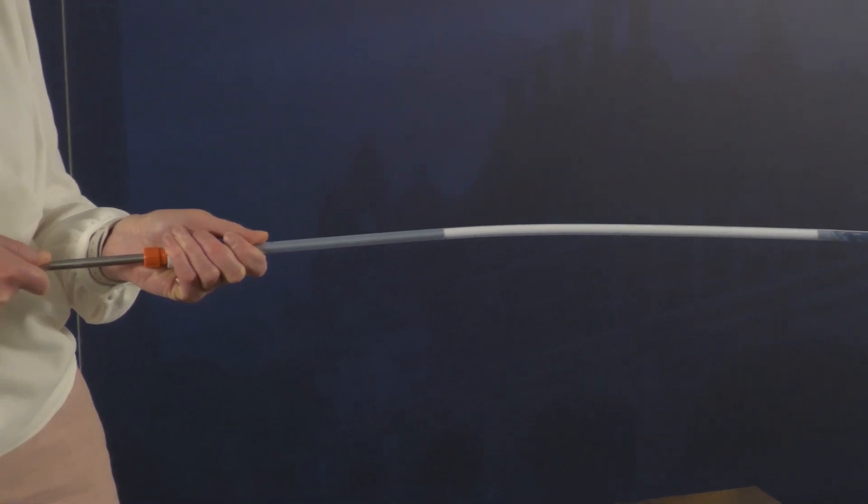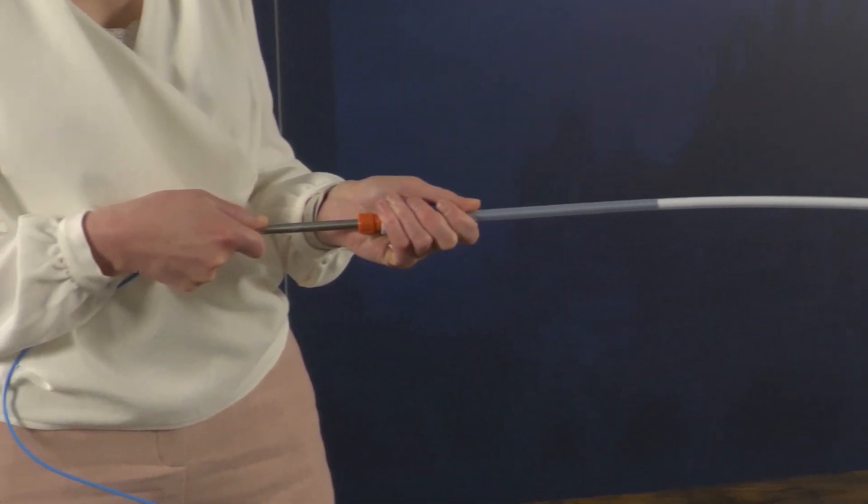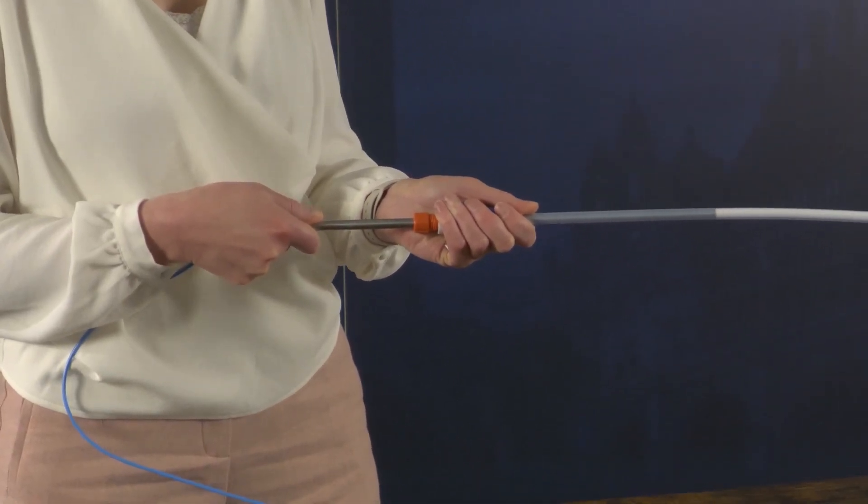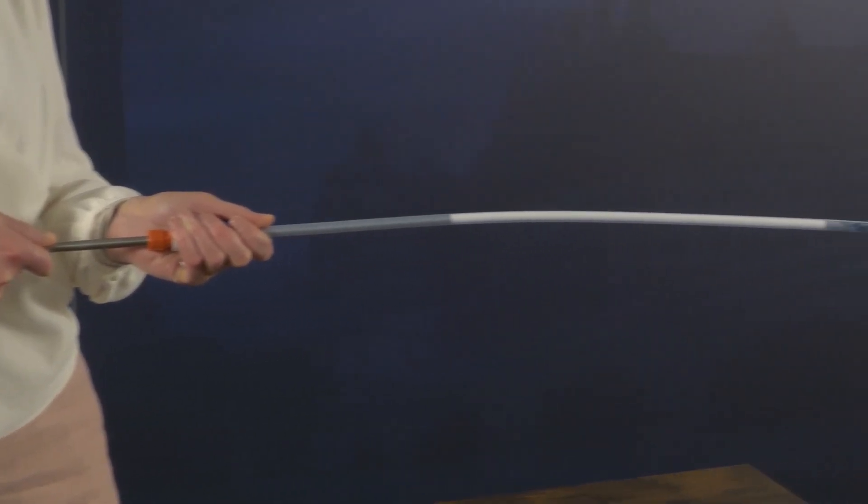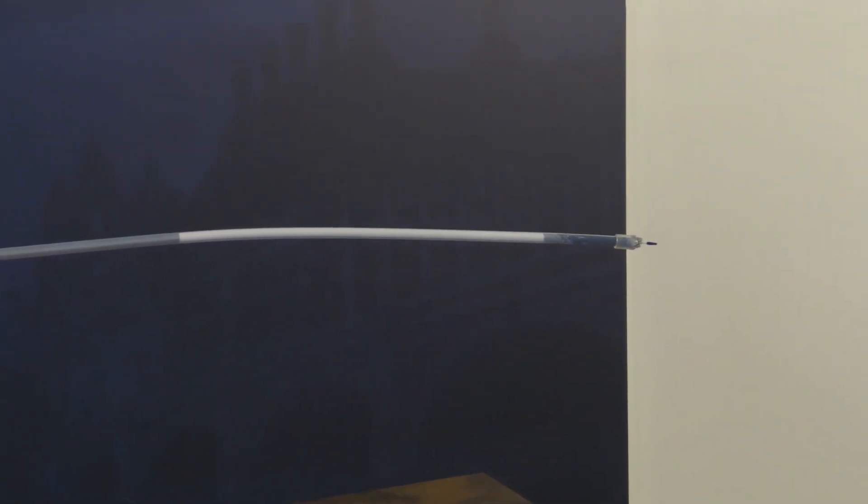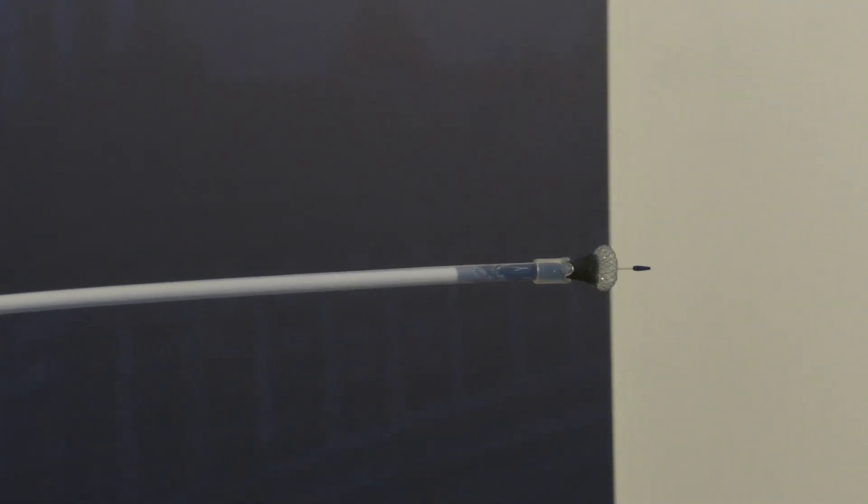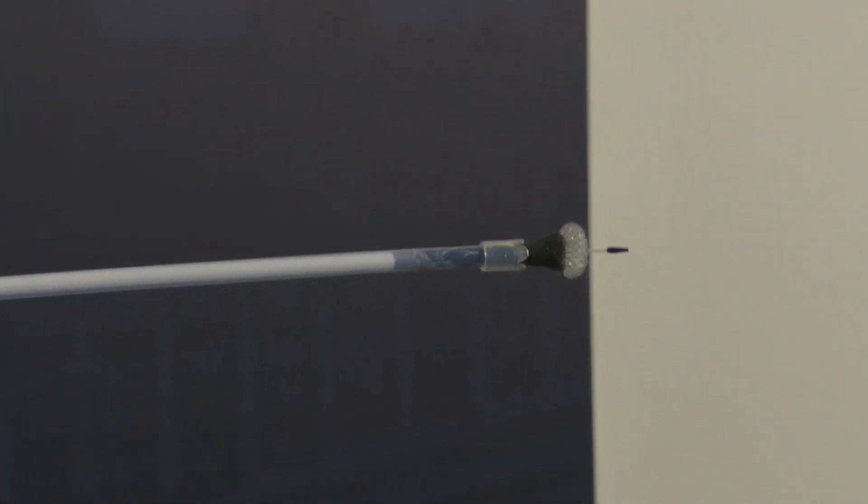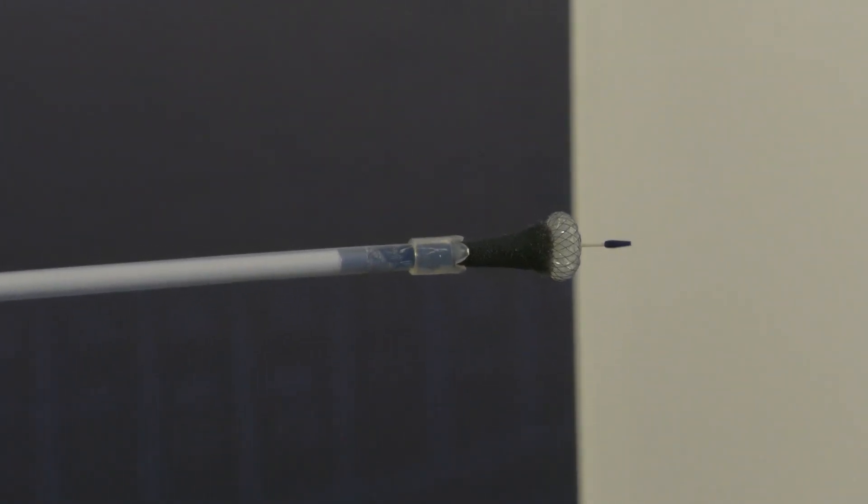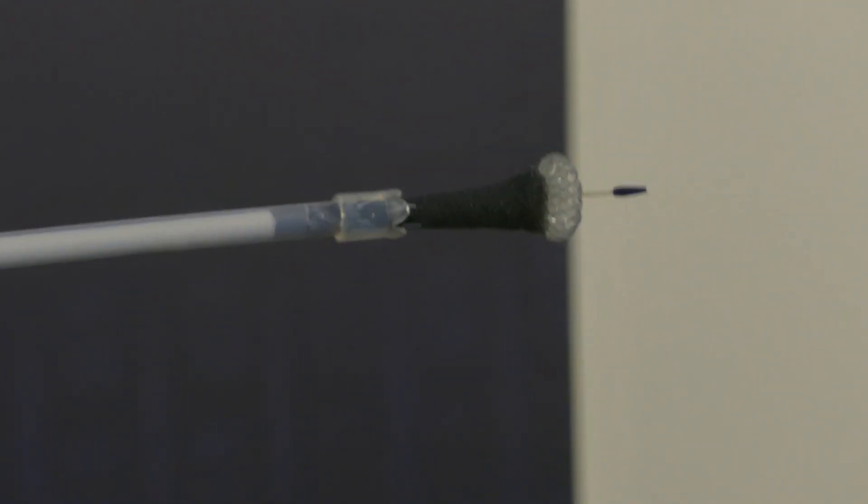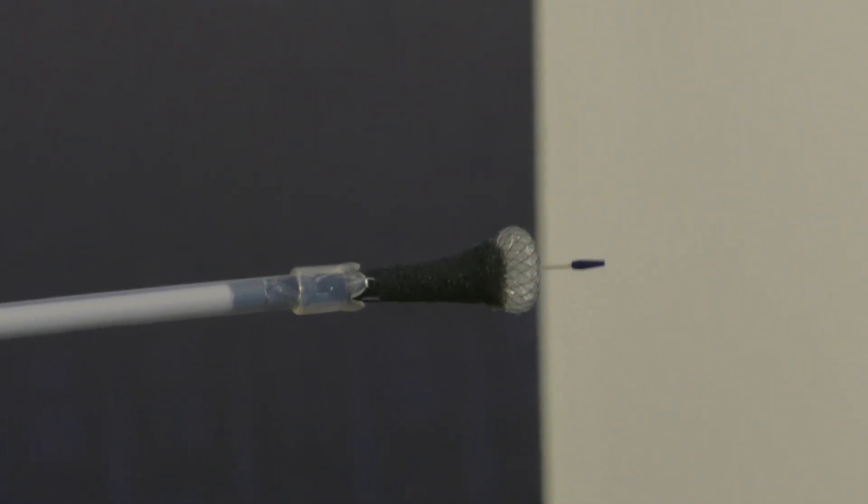If you have the end of the stent, the other end in the video - if you can move the camera to the other end - I'm just pulling my hands together and what you can see happening is that the stent is deploying. You can stop any time and reposition it, and then you just go on. There's a sort of point of no return here because if you continue, the proximal flange will also deploy.